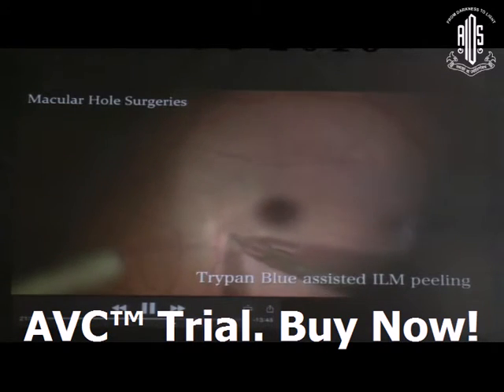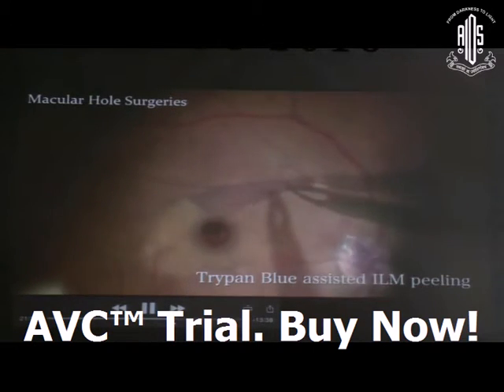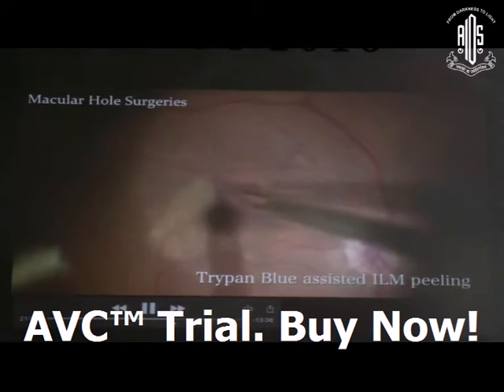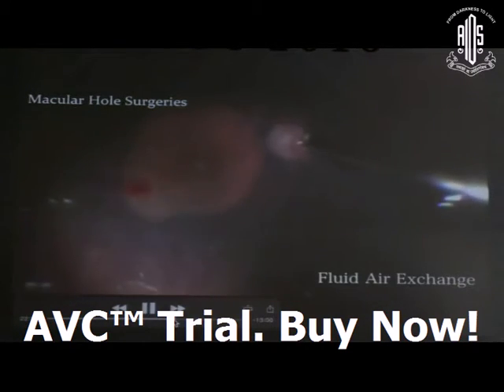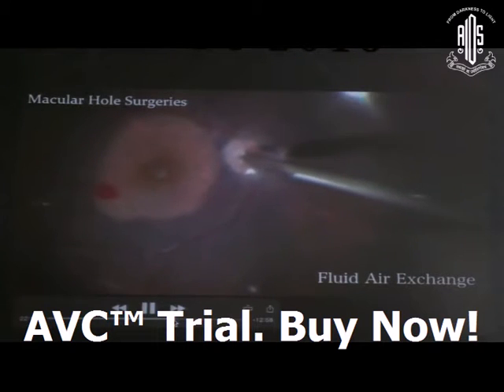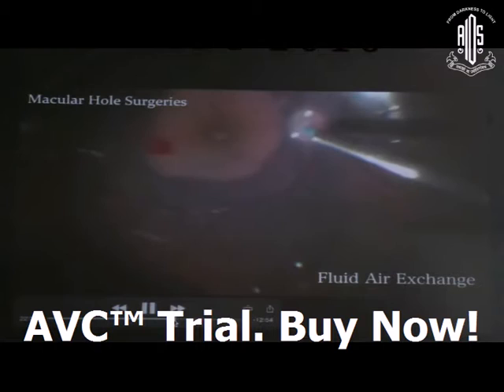You can also stain the ILM with trypan blue — it stains the ILM very faintly. In this case, peel the ILM in a clockwise manner. After ILM peeling, the next step is fluid exchange, which can be done with suction only, and also drain the macular hole to bring the hole margins closer.